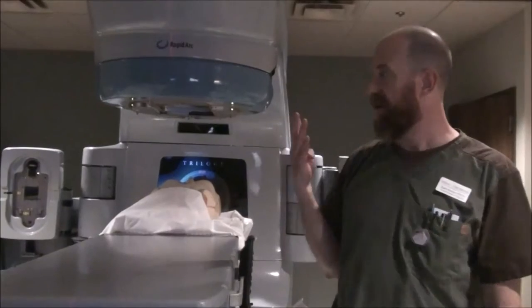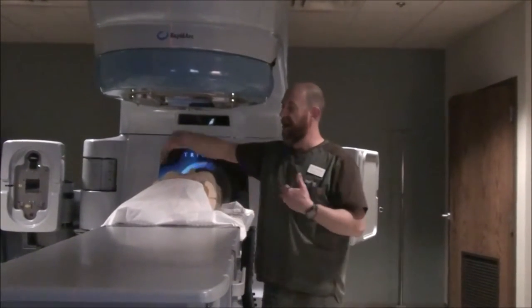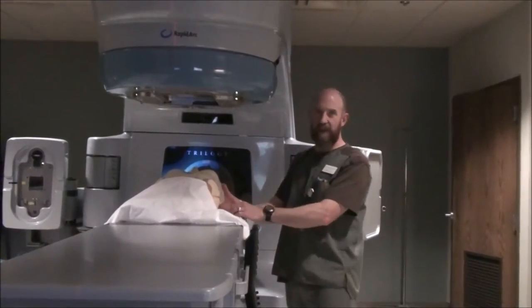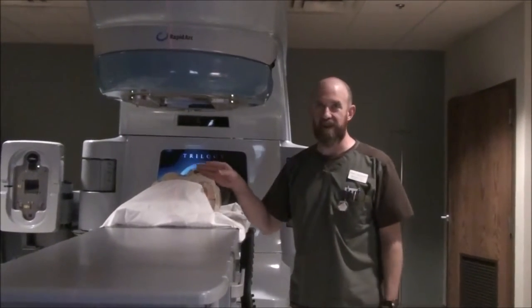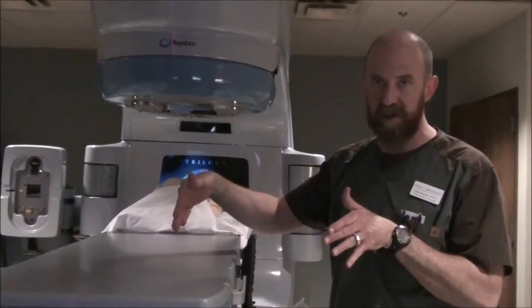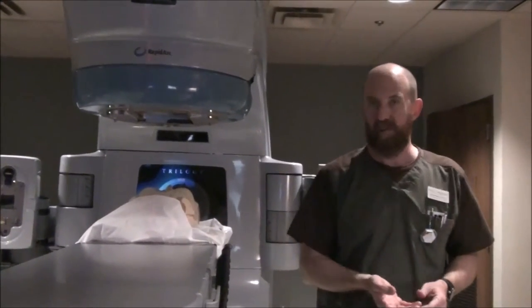You've read all four SSDs. The last thing you need to do is take separations — an anterior separation and a lateral separation, right on your marks. You always wait to take separations at the end, because a lot of times when you put that caliper underneath the patient, they're going to lift up and move. That's the very last thing you want to do — anything that causes your patient to move. Wait until you're completely finished, you've got all your marks, all your SSDs, and all the information you need. Take your separations last.